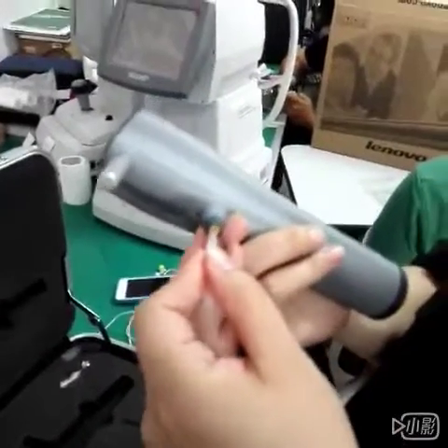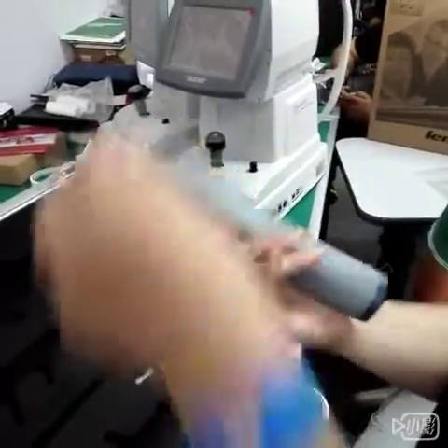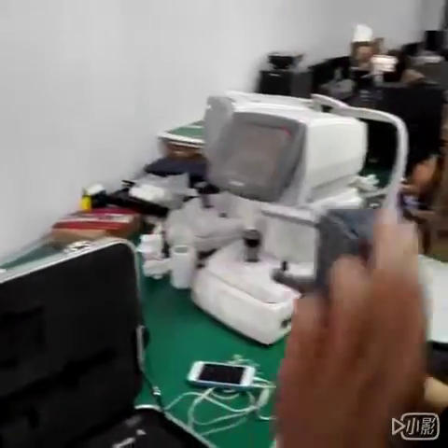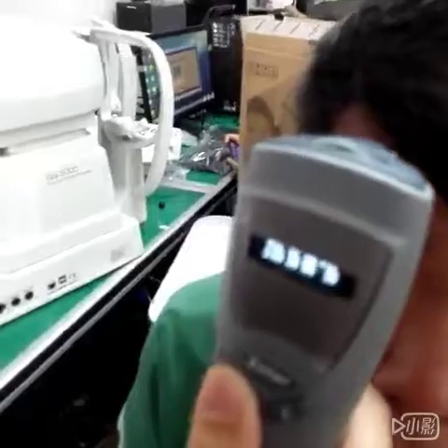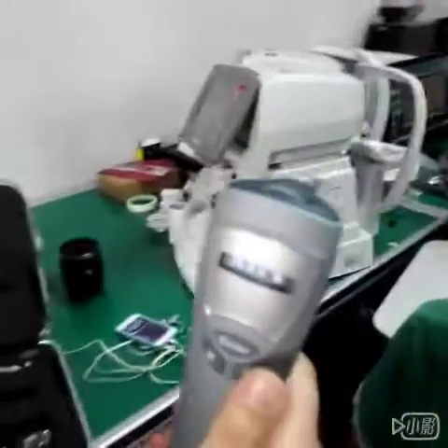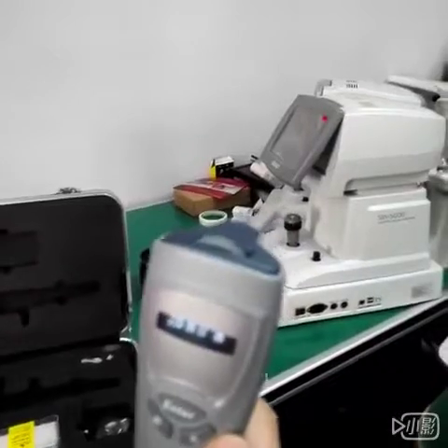Now we put on the probe. Now we measure and test on the patient. Normally we test three times and get the average at the last.